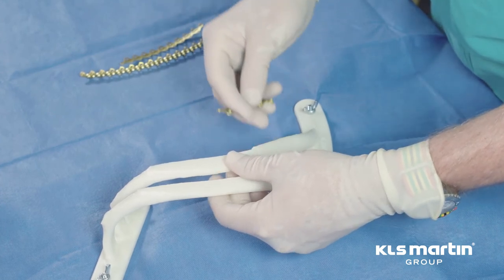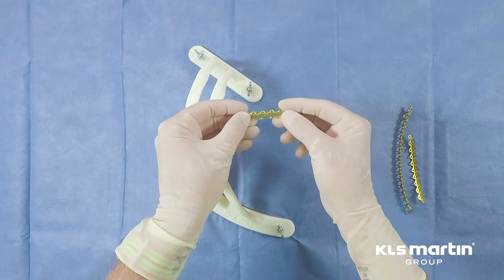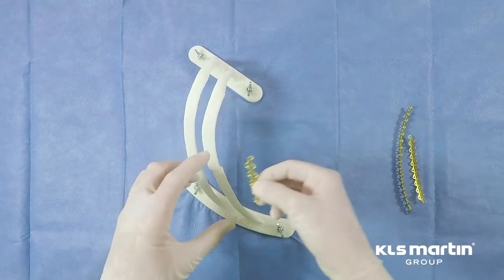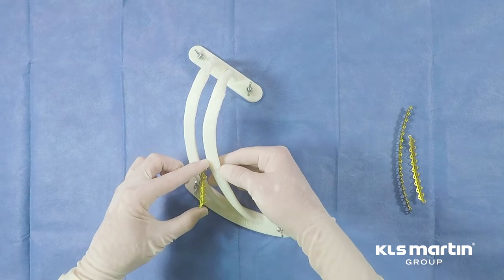The first order of business is to select your plate. For a simple transverse fracture like this, without any comminution or significant obliqueness, a 10-hole construct works very nicely.